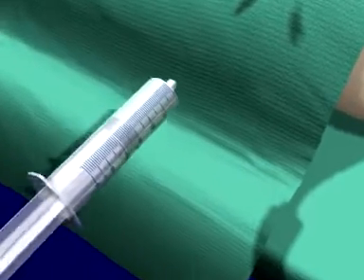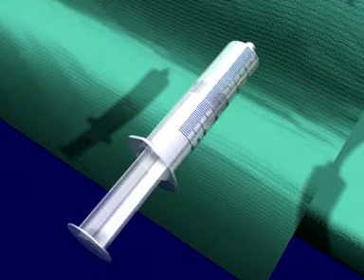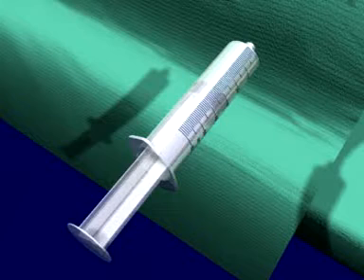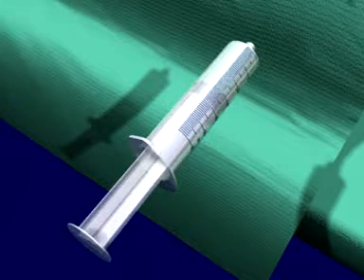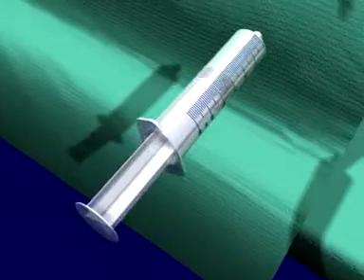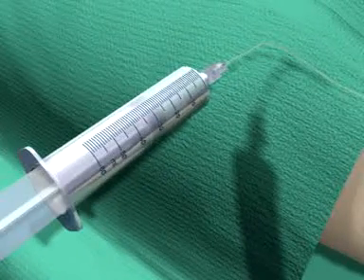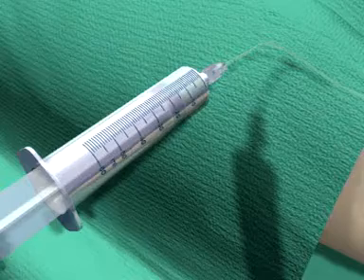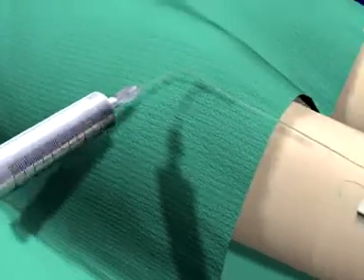A sufficient loading dose of local anesthetic is necessary for the PainCare to be effective. The 4 cc maintenance dose will not be effective without the loading dose. After the wounds are closed, attach a 60 cc syringe filled with an appropriate volume of local anesthetic to the catheter connector. Inject the medication into the wound site.